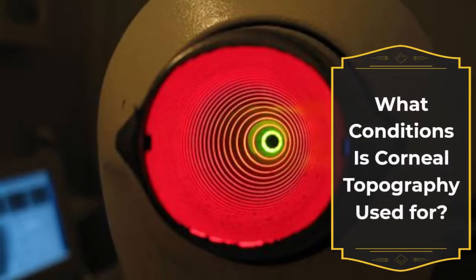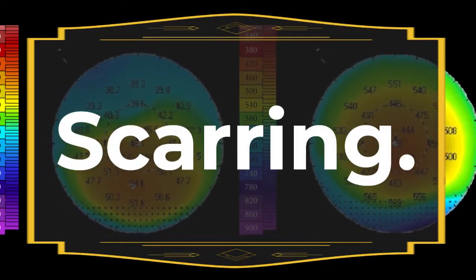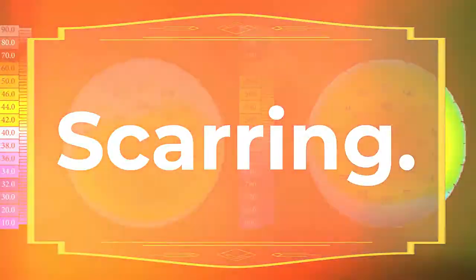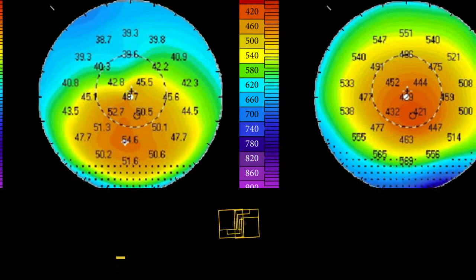What conditions is corneal topography used for? Trauma, injury, or infections can scar the cornea. This changes the shape of the cornea. A topography scan measures the distortion and its effect on vision.